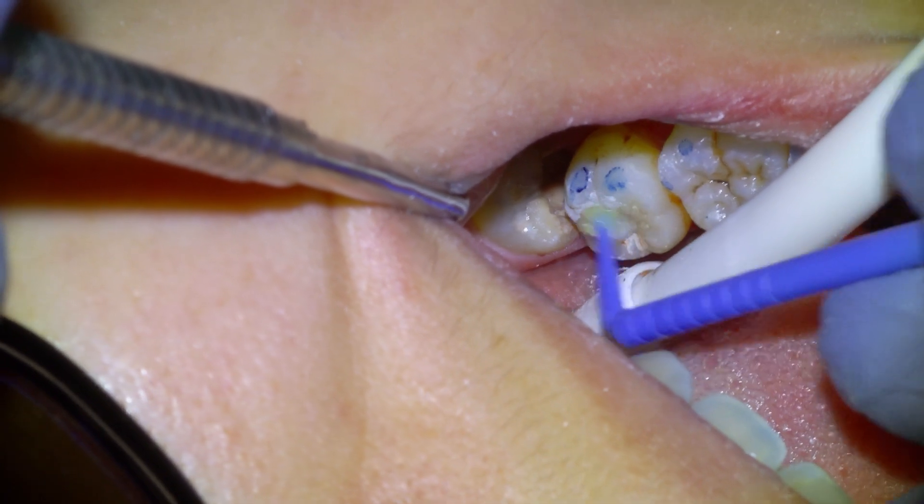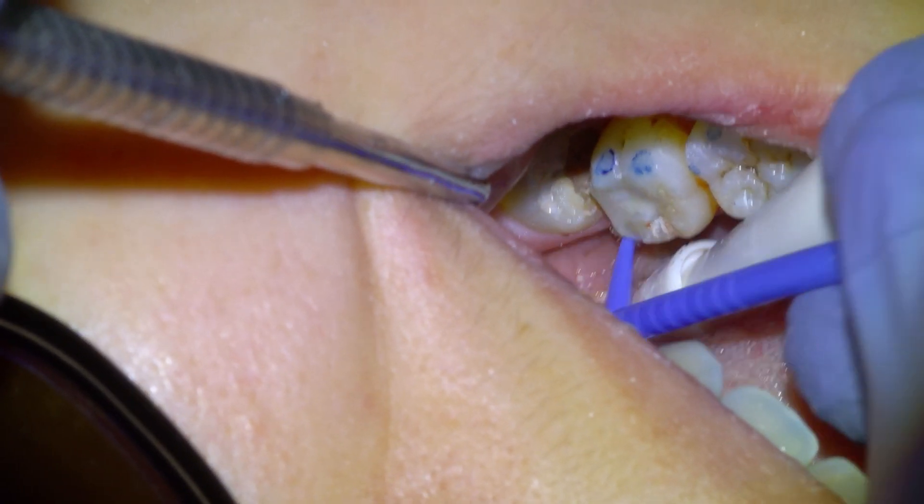We're going to apply the Equia Coat varnish agent and then light cure that with our Velo Grand.